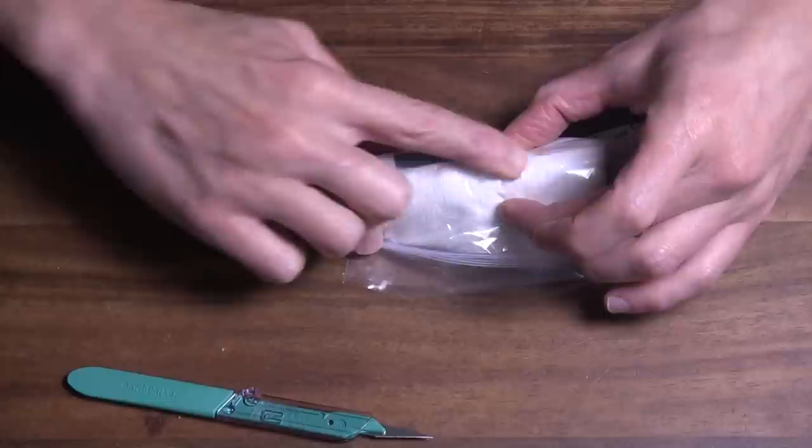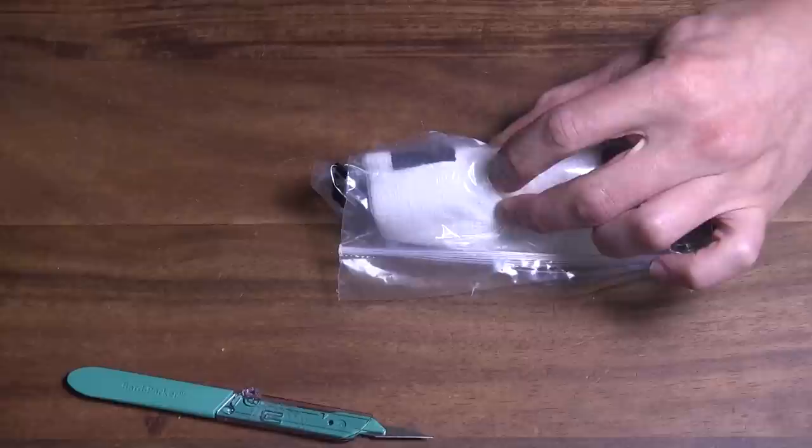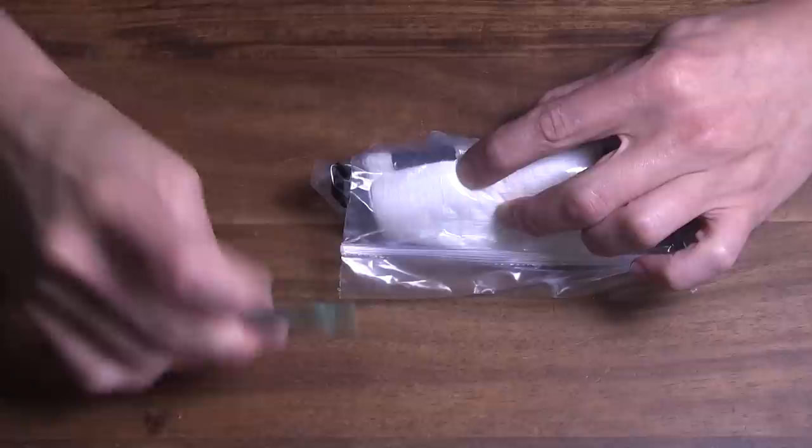So now I'm going to put my non-dominant hand, thumb and middle finger locked to the broad portion of the thyroid with that same index finger. I could repalpate. I know exactly where I'm going. Now I'm going to get the scalpel in my dominant hand. My hand is stabilized on the patient in both cases.